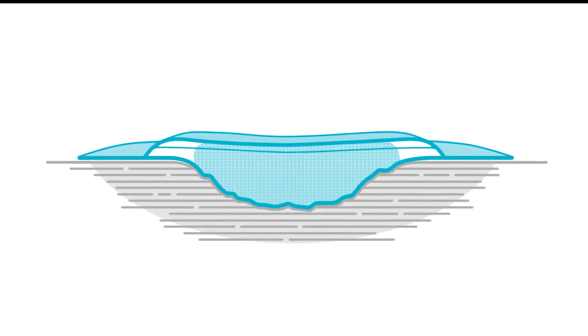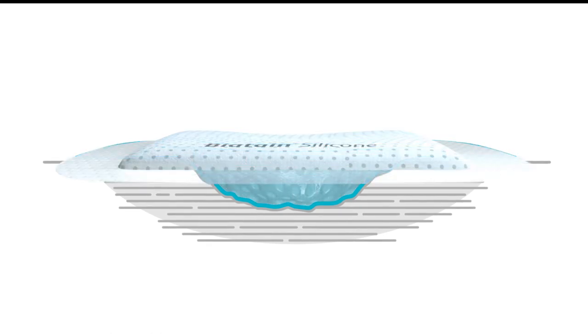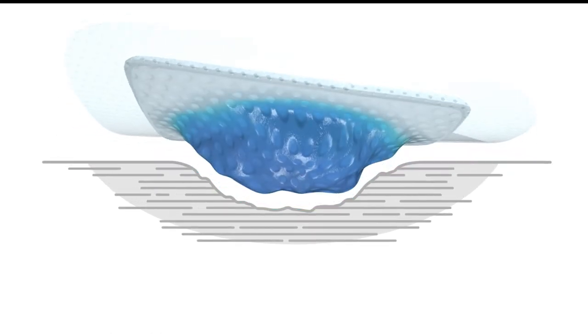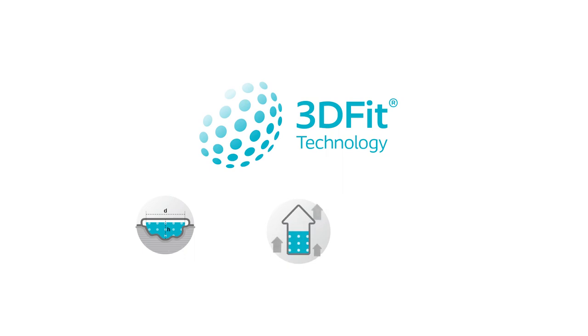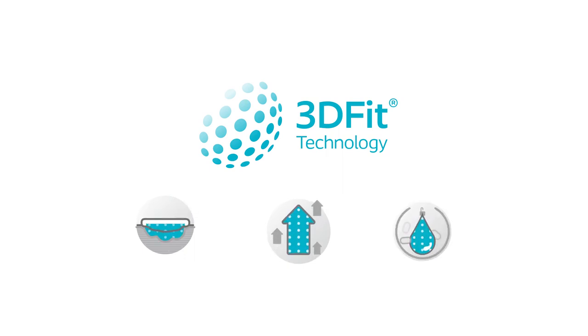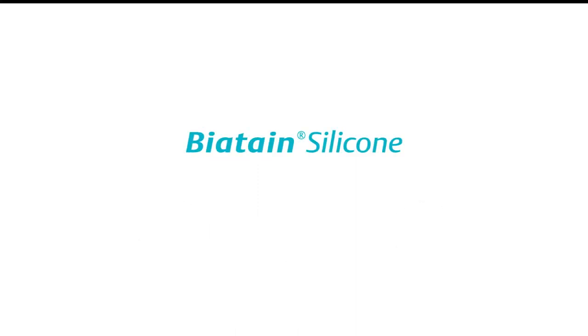As a result, the exudate is effectively managed. Biatain Silicone with 3DFit technology ensures that patients get a perfect fit every time. Patients will experience the benefit from conformability, vertical absorption and retention, which promotes optimal healing conditions. Biatain Silicone, a perfect fit every time.